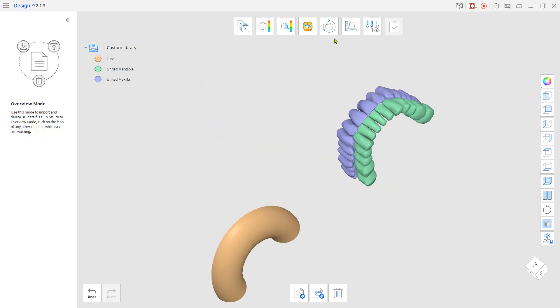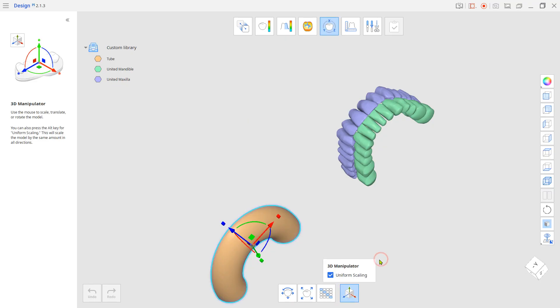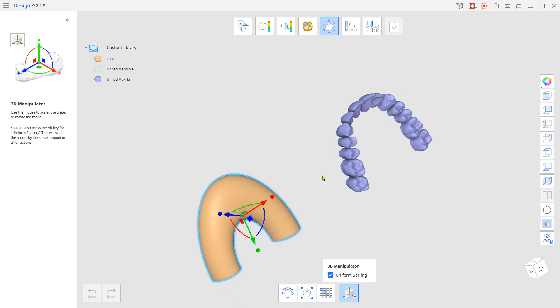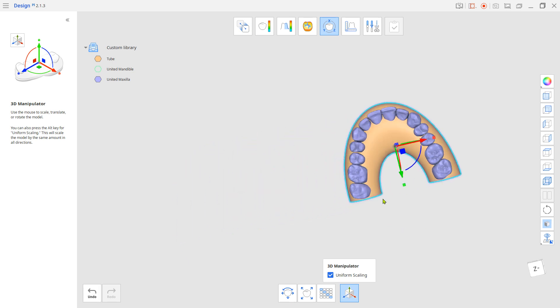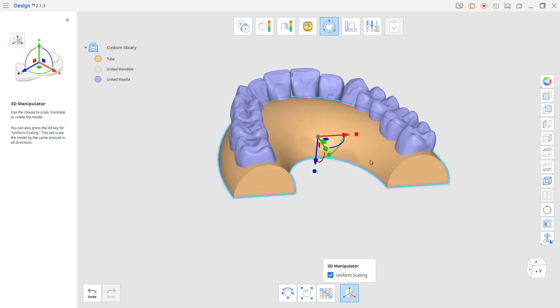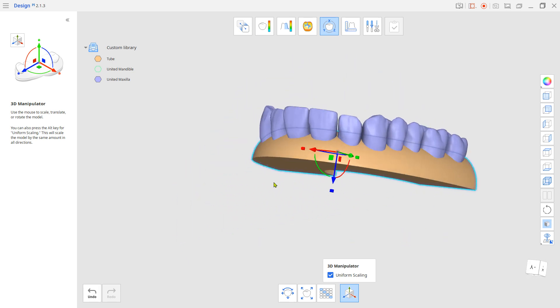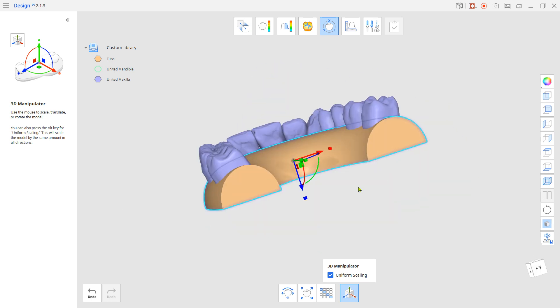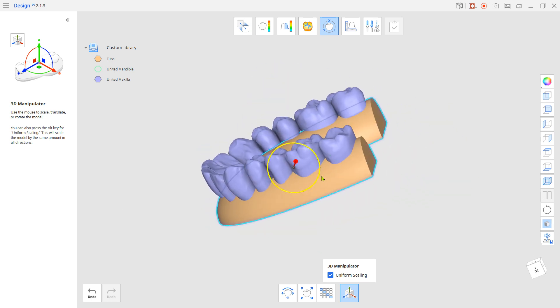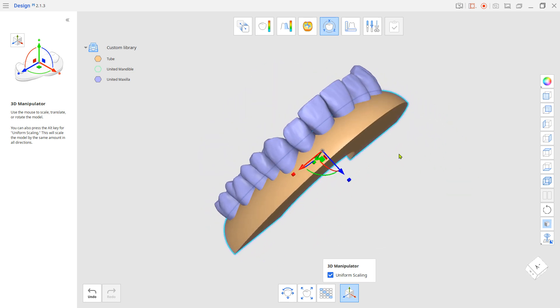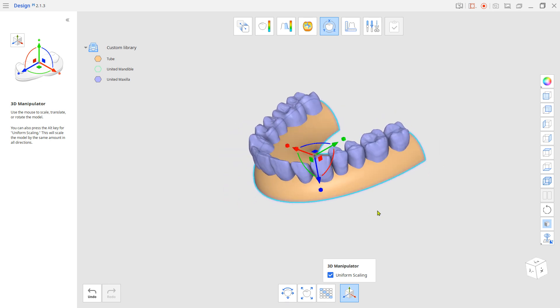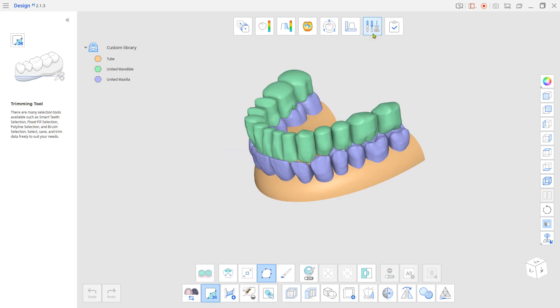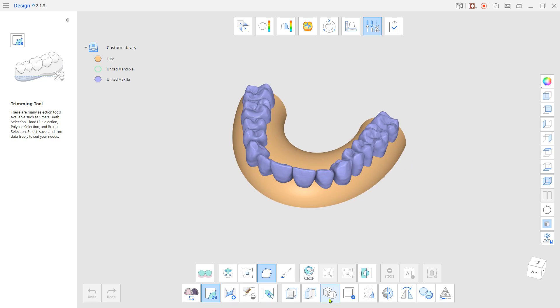Go to transformation mode and relocate the tube STL to the maxilla base. Make sure all the teeth are buried lingually and buccally into the tube. Go to edit mode and use Boolean Union to merge the tube and the maxilla.